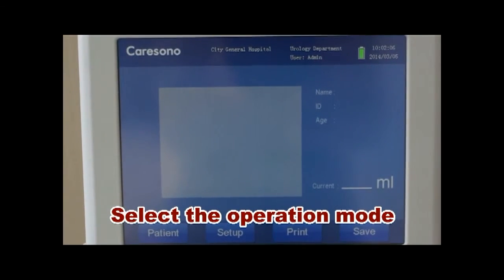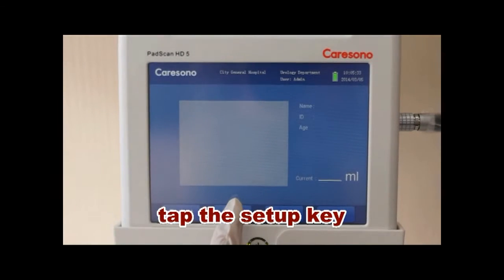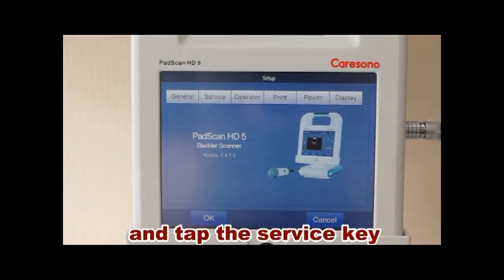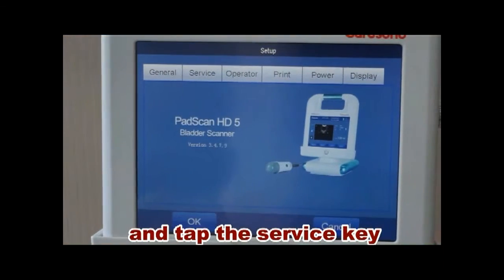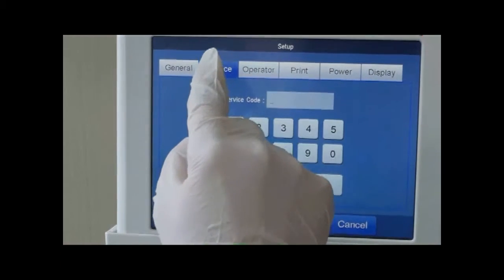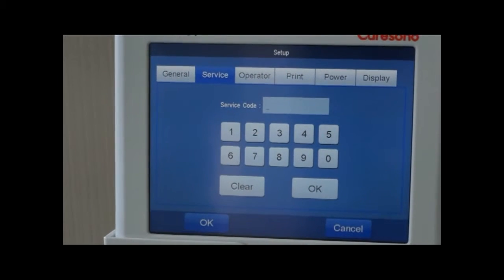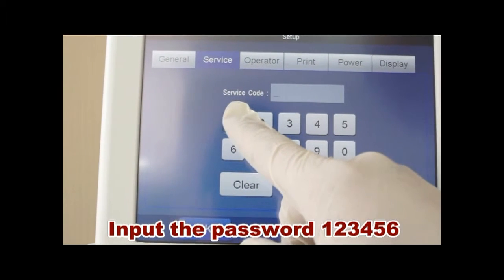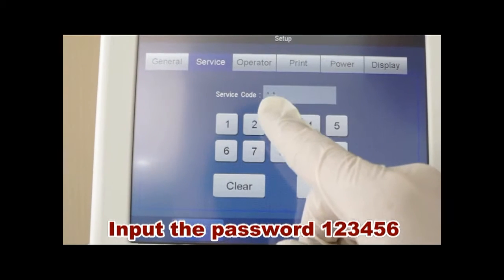Select the operation mode, tap the setup key, and tap the service key. Input the password 123456.